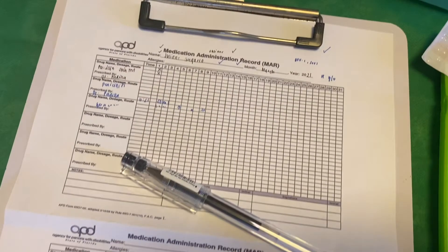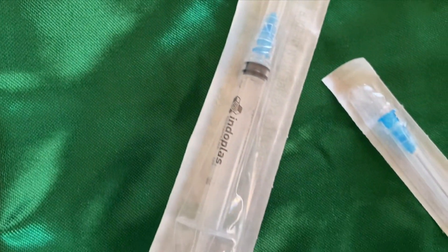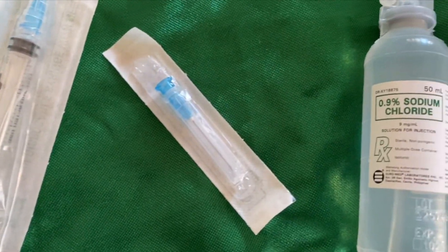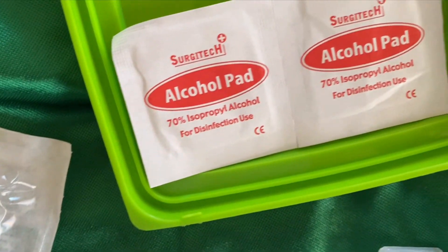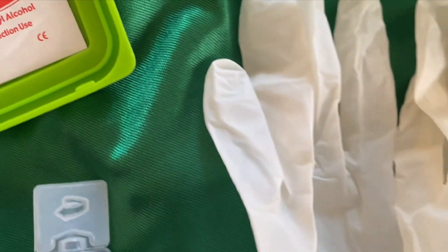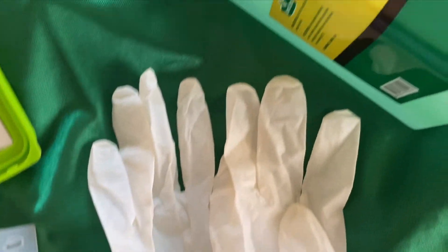The medication administration record, syringe 1-3 ml, needle 19-23 gauge, medication ampoule or vial, alcohol pad, gloves and alcohol.